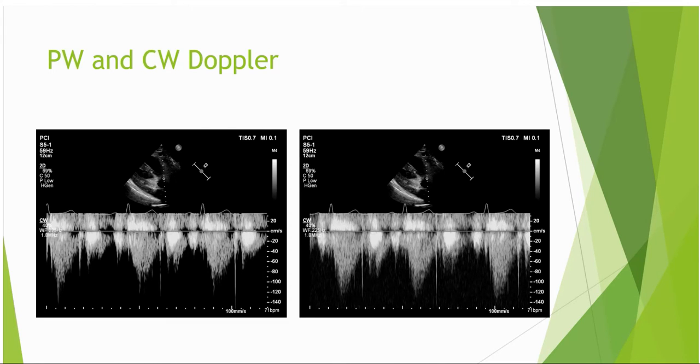Another fairly underutilized function, but a handy one in the right situation, is reject. It's a knob on the option list on the system. This function basically removes low-level signals from the screen, which can be useful if there is a lot of fluff along the outer edge of the flow profile that you want to trace a VTI over, or the peak velocity is lost in smeary haze.